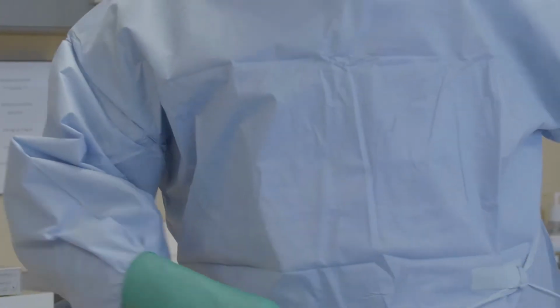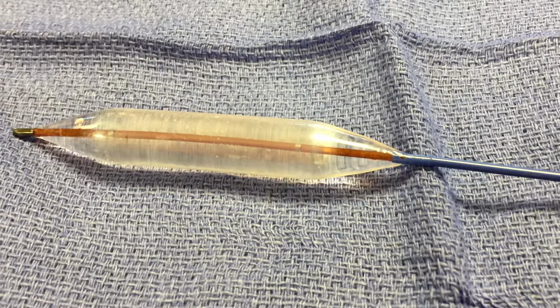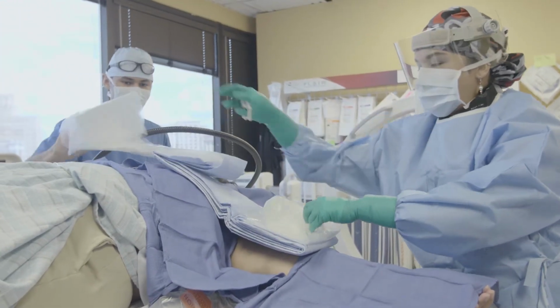So we bring the patients in for a fistulogram at Total Vascular Care. We run some dye through the vein to diagnose problems, which are usually a narrowing of some sort. These narrowings have to be angioplastied. That basically means you advance a balloon to that area of narrowing and you dilate that area so that the diameter of the vessel goes back to the original size so that blood can flow better and they have no problems on dialysis. This way they get better blood cleaning as well.